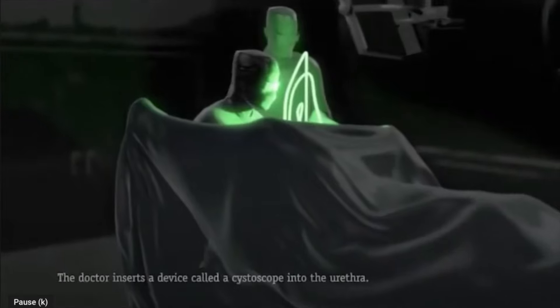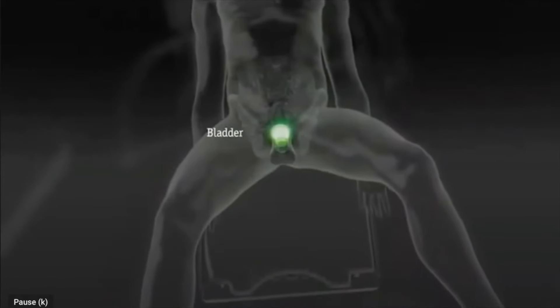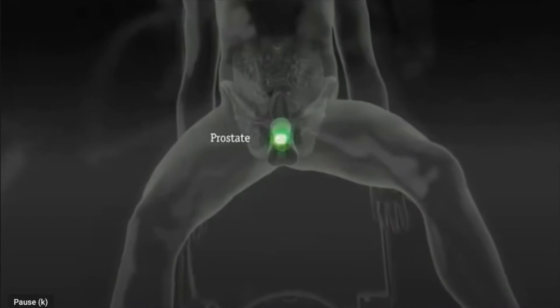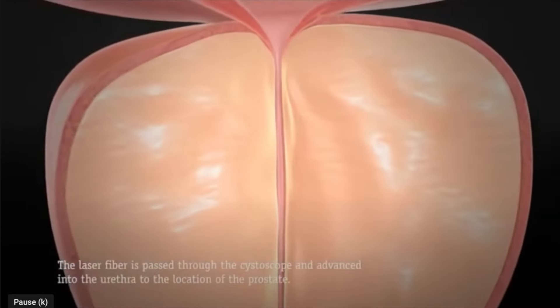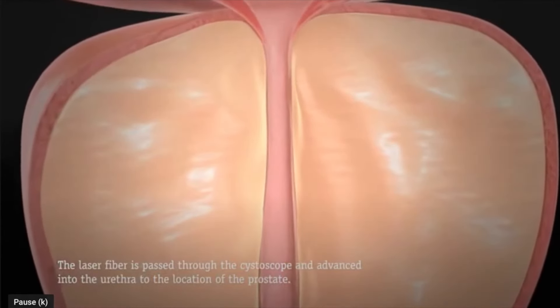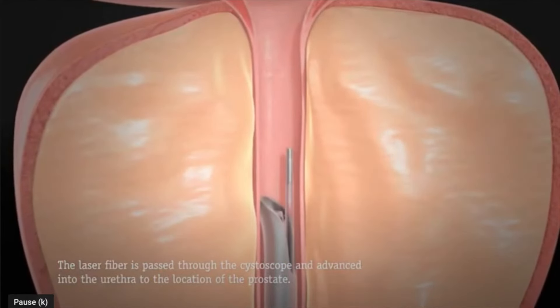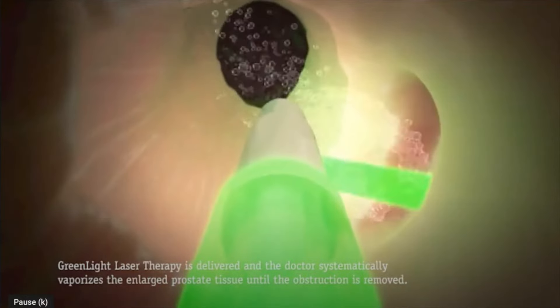I'm going to have a look now at an animation. Green light laser surgery is performed in hospital under a general anesthetic. A telescopic camera is inserted through the urethra to allow direct visualization of the enlarged prostate. Through the center of the telescopic camera, a very fine laser fiber is then inserted.